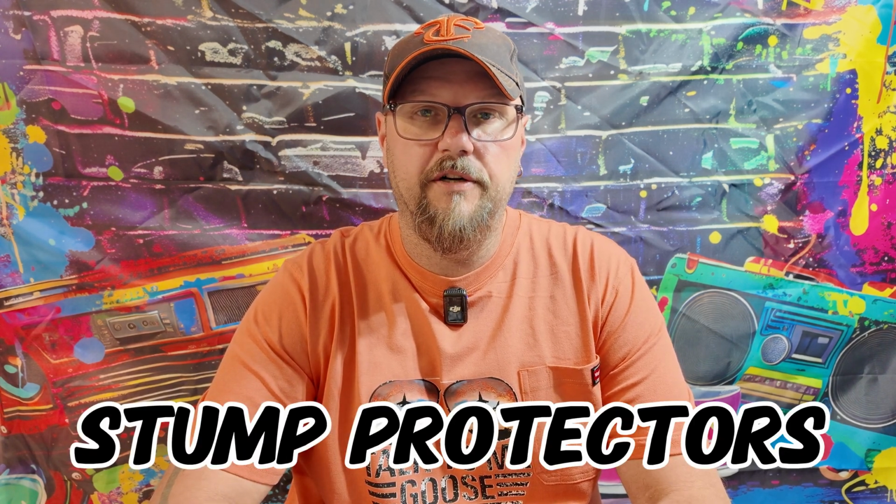Today we're going to talk about stump protectors and are they really important? So short answer is yes, stump protectors are very important after having an amputation. A lot of times patients tend to damage their stump from bumping or hitting their stump shortly after amputation, which will prolong their healing process.